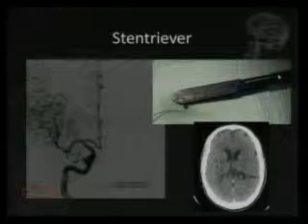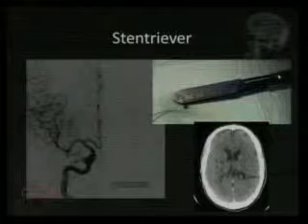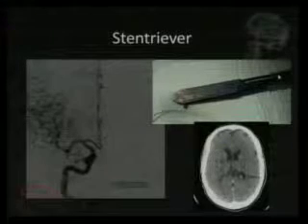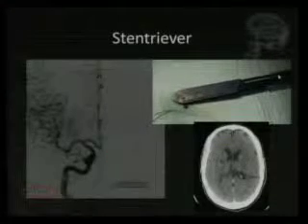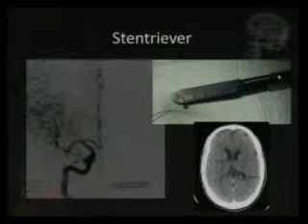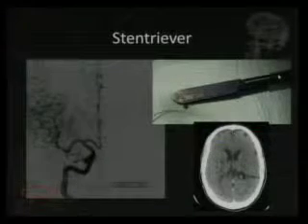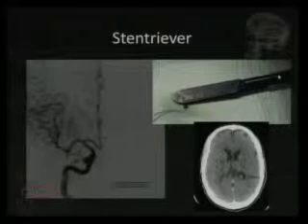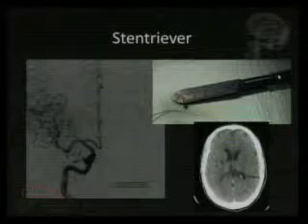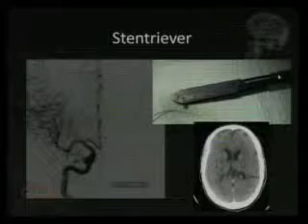So when you're doing it, you're parking another catheter close and you're just using a microcatheter? We have a guiding catheter down here at the cervical ICA, so that stays there. So you can get in and out relatively quick. Exactly. So that bigger catheter, an 8 French or a 6 French catheter, you can park it at the cervical ICA, just at the neck, and then you just advance your microcatheter inside the head. And then when you pull that system of the microcatheter stent out, you're left with your guiding catheter, and you just go back in again with everything.